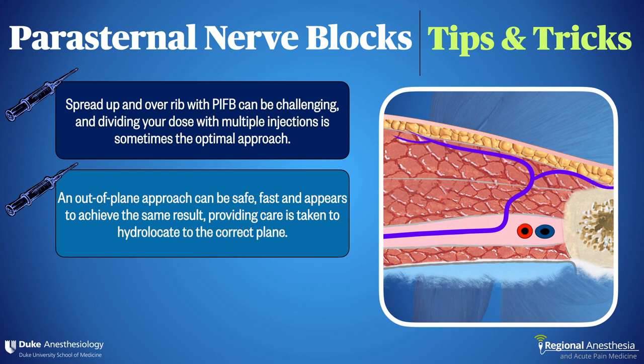Secondly, an out-of-plane approach is fine too, and sometimes can be quicker and easier, especially if there's a lot of muscle on the chest wall that might make an in-plane approach challenging. Careful, frequent hydrolocation is the key to safety here.